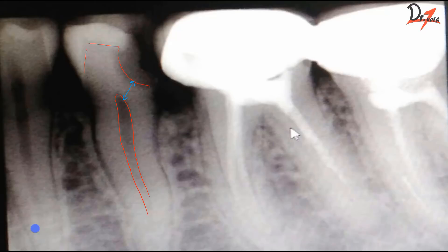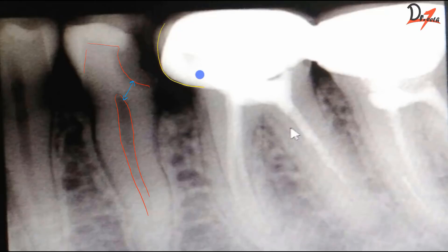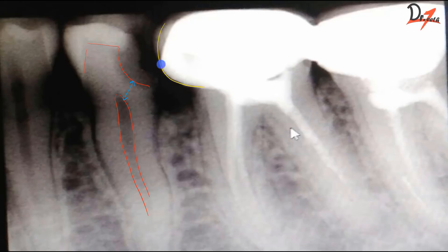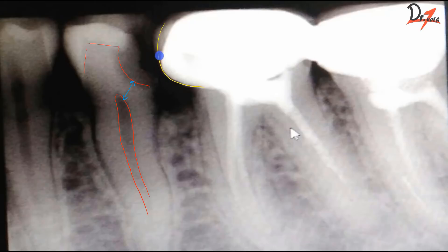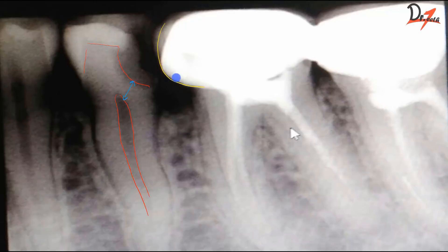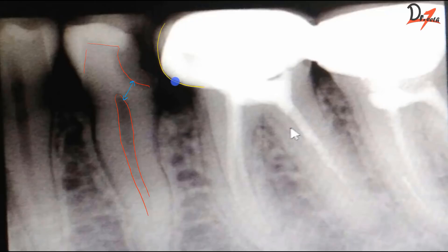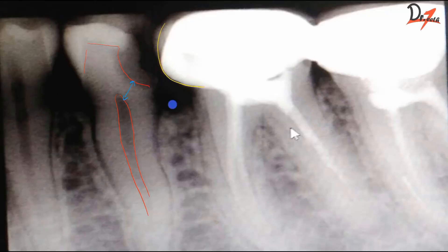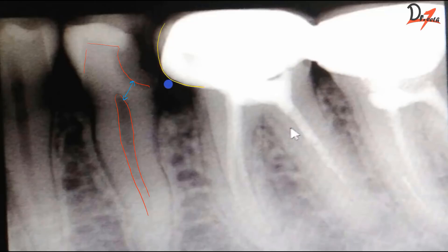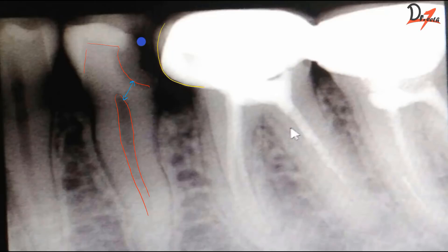In this radiograph, we can also see a crown on the adjacent teeth. This crown has an overhang — the proximal side has not been properly contoured — and this was probably the reason why food was accumulating there, leading to the decay of the tooth in the first place.